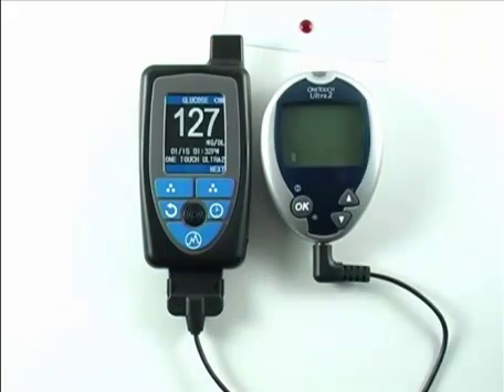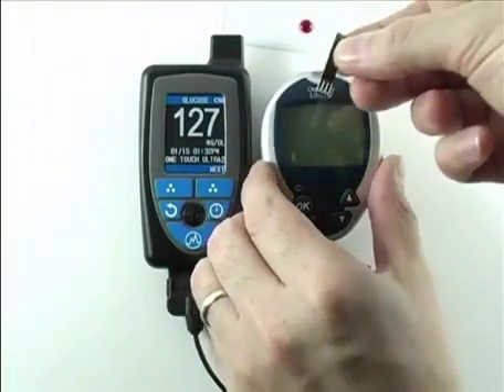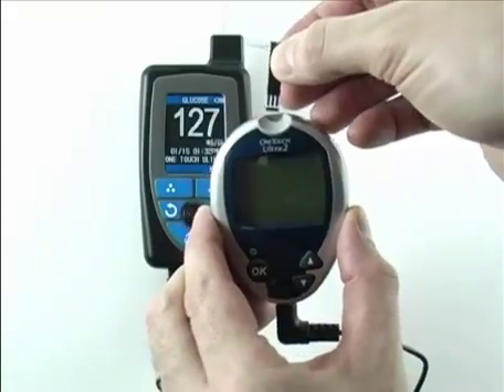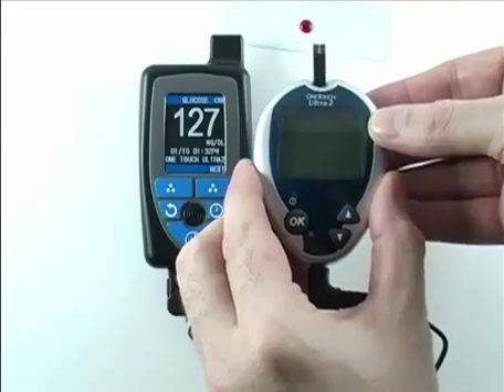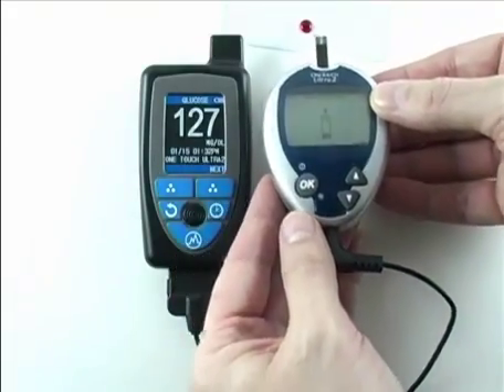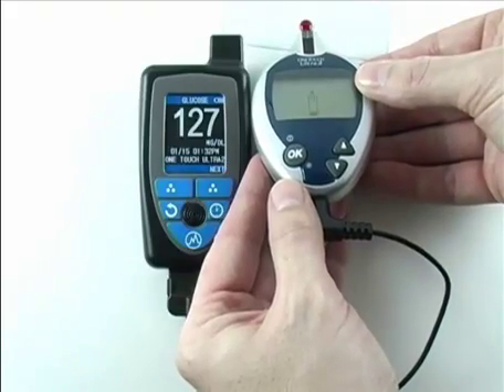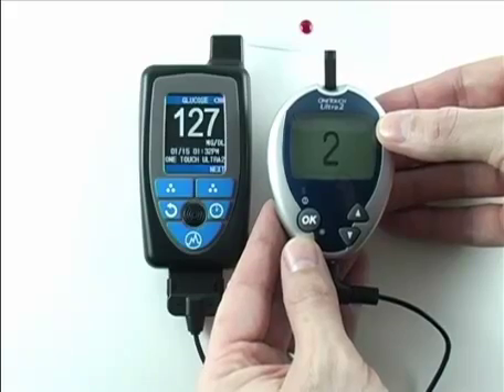Instead of blood, we will use control solution for this demonstration. Next we will take a test strip and insert it into the meter to wake it up. The meter will display the test strip calibration code number and then prompt for blood — in this case control solution. We collect the sample and the meter counts down as it registers the reading.